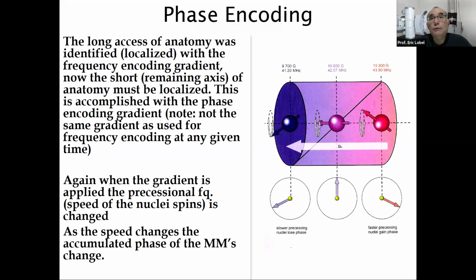of K-space. And we will have a separate lecture on K-space, but very quickly, you can look at K-space as a big square with 4 quadrants, right? So 1, 2, 3, 4, a top half that's considered positive, a bottom half that's considered negative. And all across we have many, many lines, right? We might have 64, maybe 128 lines, potentially maxing at 256.